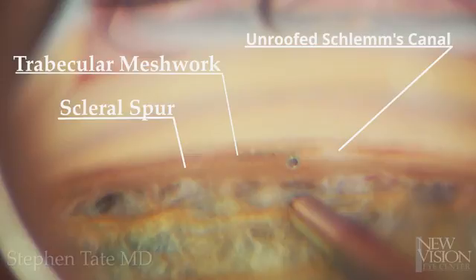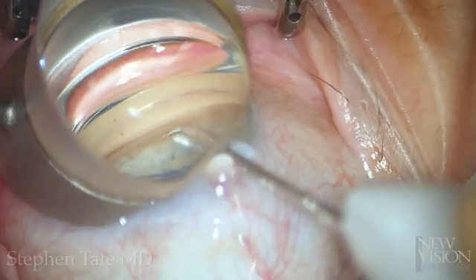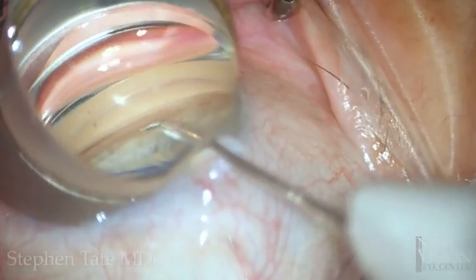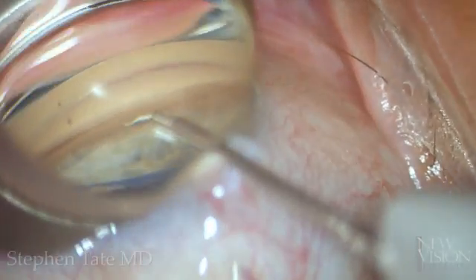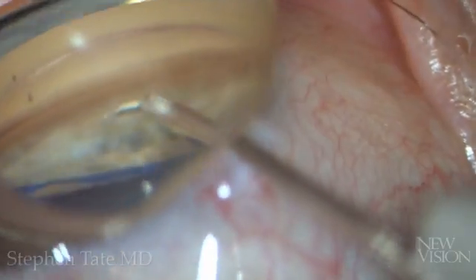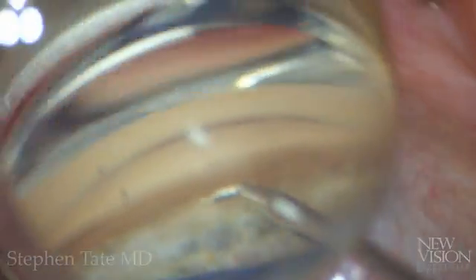Step four is device injection. Once the scleral spur and ciliary body band have been identified, the device being used is deployed through the trabecular meshwork into Schlemm's canal.